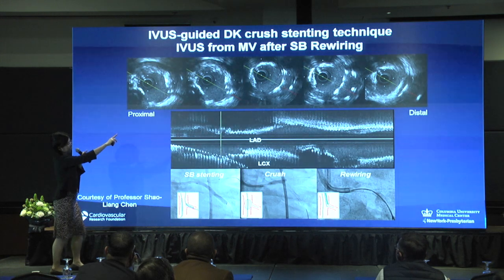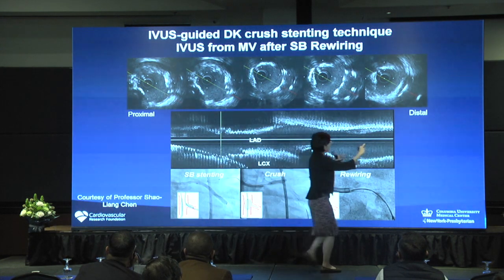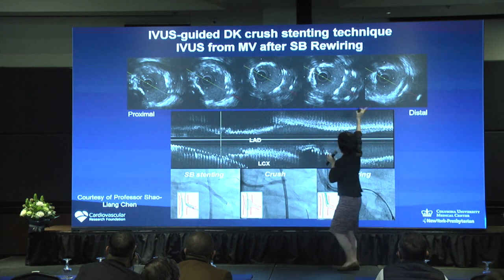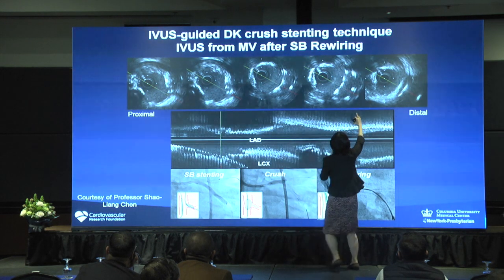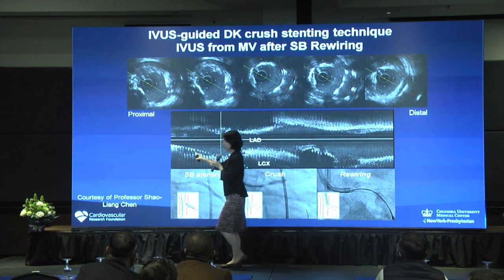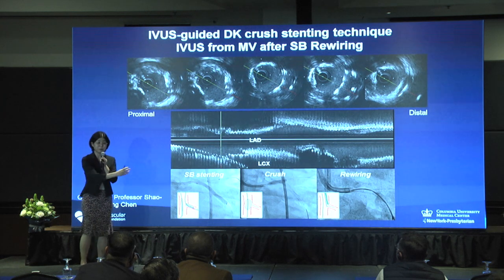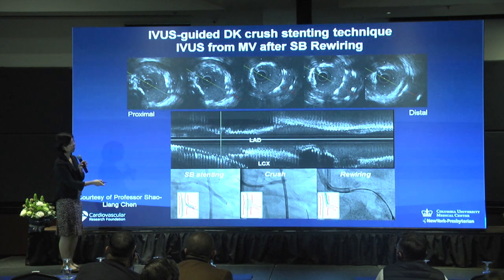So how can you do it? This is an IVUS picture. You look for the circumflex wire from the LAD branch. This is the circumflex wire, and based on this, you rotate the longitudinal picture by rotating this plane, and once you rotate, you can see the nice wire through the circumflex. That's very easy to do. So I recommend checking wire location by looking at the longitudinal picture.